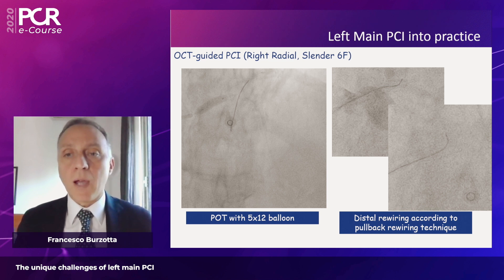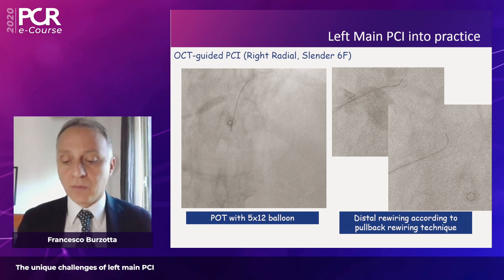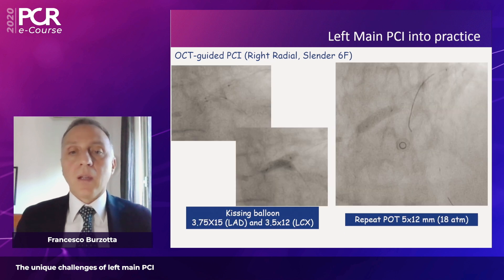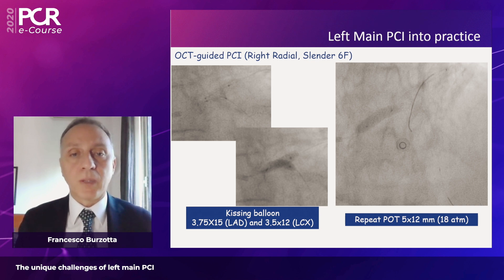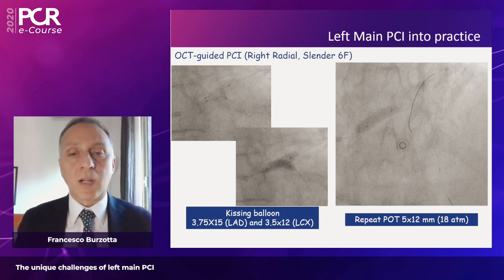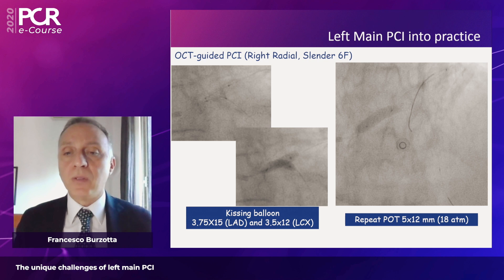For circumflex rewiring, a workhorse wire was appropriately shaped and the best angiographic incidence — which was surprisingly the cranial view — was used. Pullback rewiring was performed entering the distal portion of the large circumflex. Two balloons were then advanced for kissing balloon inflation: 3.75 mm for the LAD and 3.5 mm for the circumflex, appropriately sized. Sequential dilation was performed individually to check expansion of each balloon, followed by simultaneous kissing balloon inflation, and then a repeat POT with the same 5 by 12 mm balloon at high atmospheres.